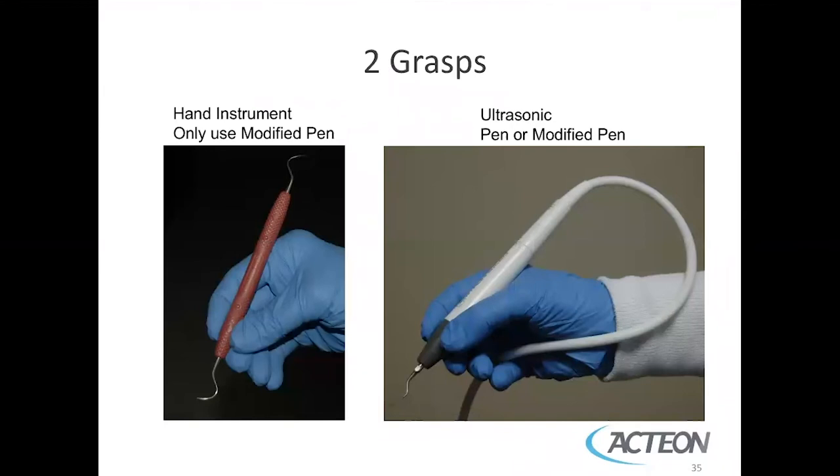There are two grasps utilized in ultrasonic scaling: the modified pen grasp or the pen grasp. The most important thing is that there's space between the pointer and the thumb on the handle so that you can roll around the line angles. In addition, you can tuck the cord between the ring finger and the pinky finger.